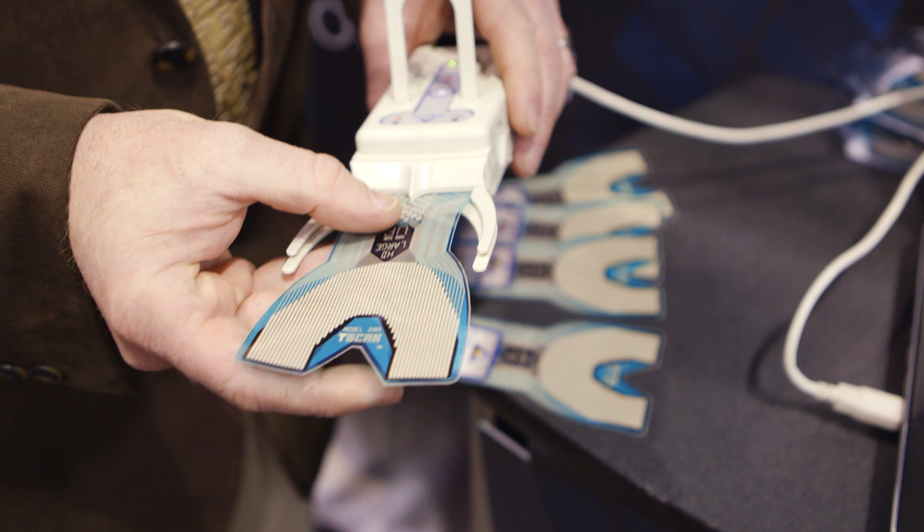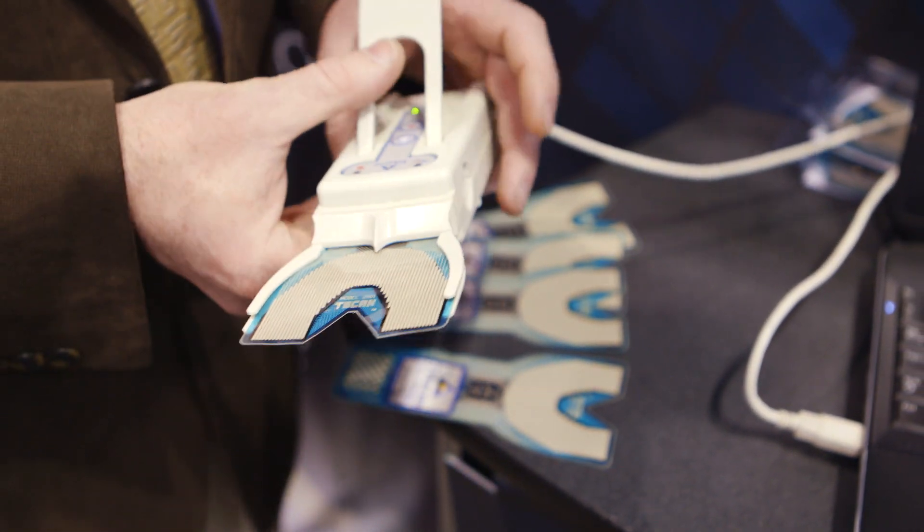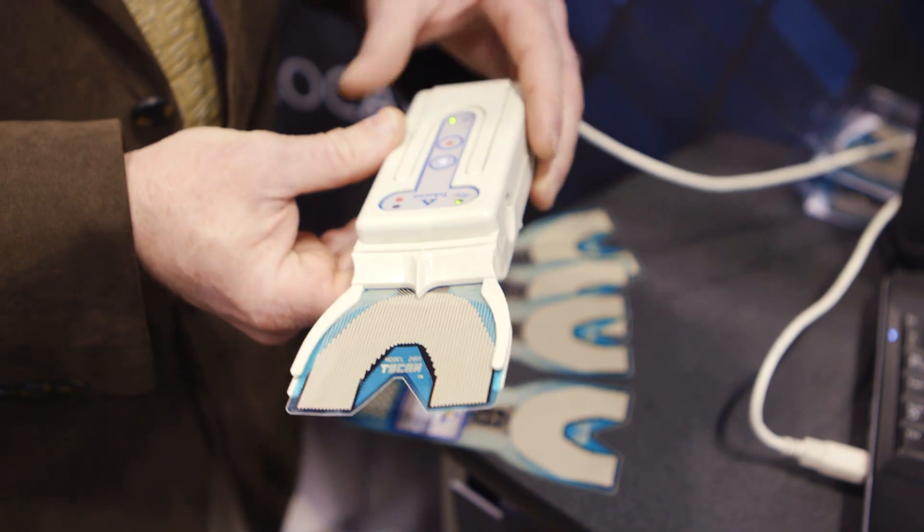It's easy to use, it's efficient, it's inexpensive. You can do it on every person, you can do it on people where you have a concern. I do it on some patients just to be sure everything is right.